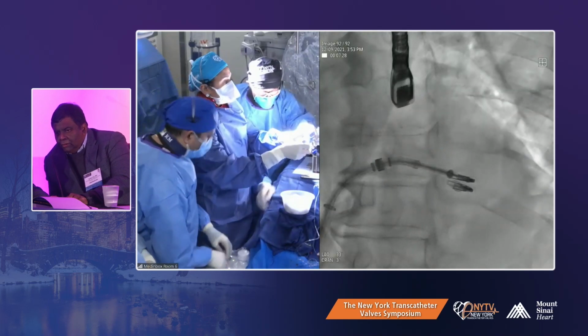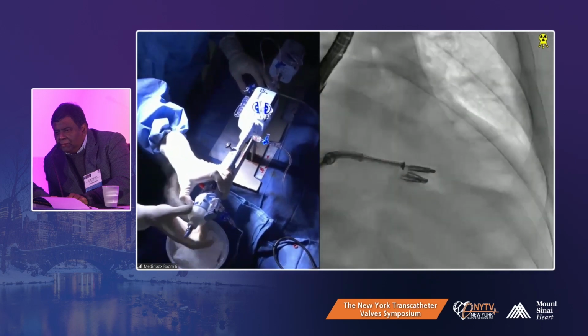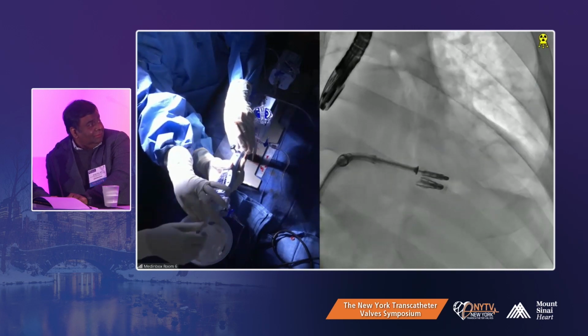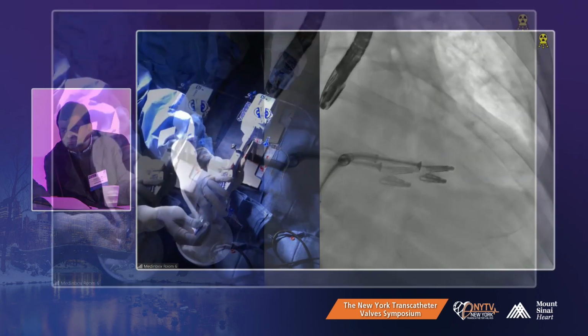Good. One of the things I used to train with MitraClip is to take 15 minutes on the clip transseptal and only 5 minutes for steering. We're deploying the clip. Right. Grippers.